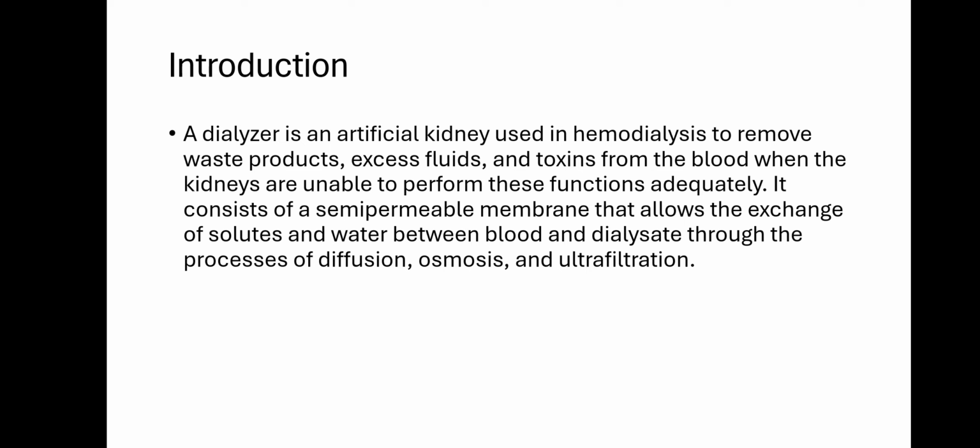A dialyzer is an artificial kidney used in hemodialysis to remove waste products, excess fluid and toxins from the blood when the kidneys are unable to perform these functions adequately. It consists of a semi-permeable membrane that allows the exchange of solutes and water between blood and dialysate through the processes of diffusion, osmosis and ultrafiltration. These are the three main principles of the dialysis process.